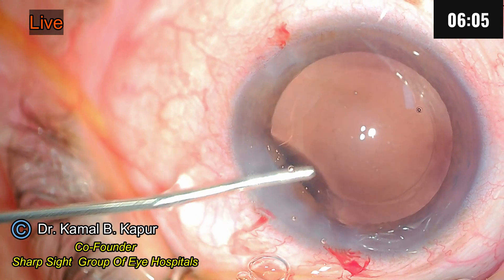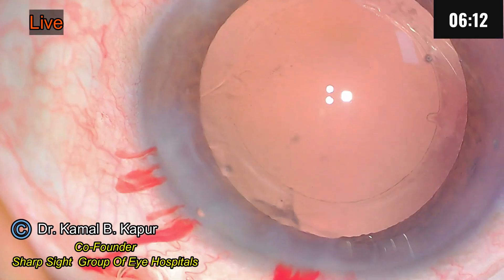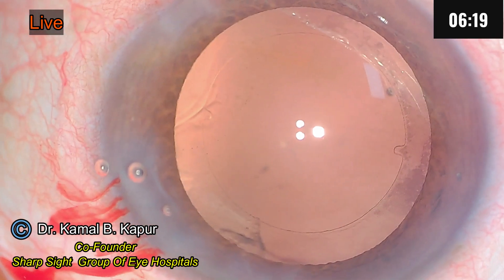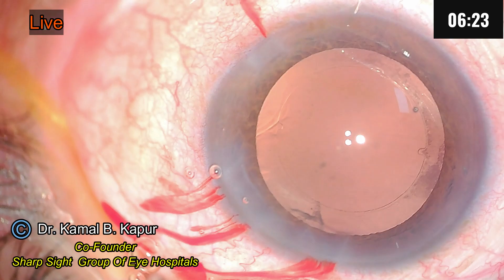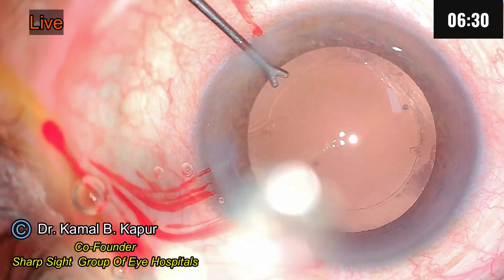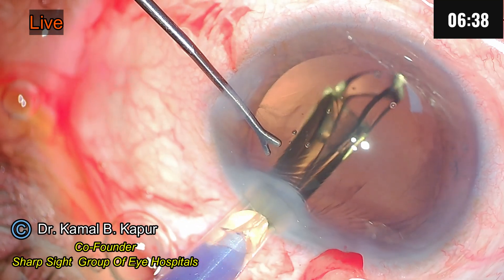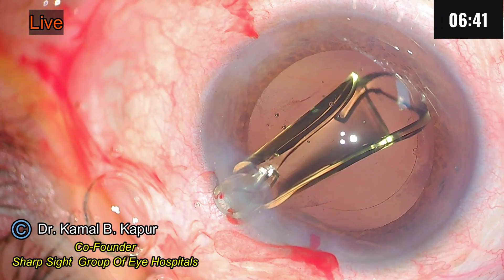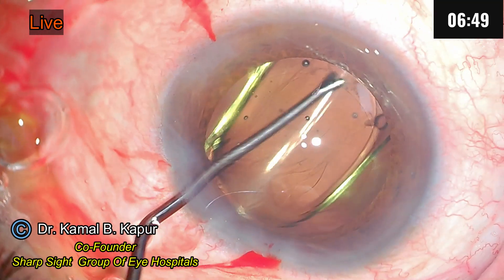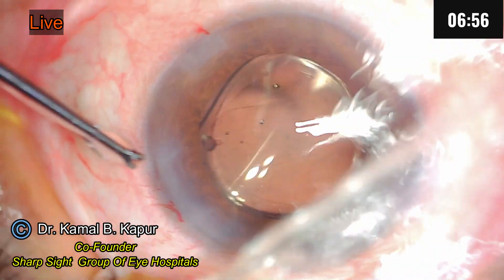Now you will be able to appreciate those two small nubs on the capsular axis — there is one here and one here. These two are visible, and this is my alignment for putting in the IOL. Now we always under-rotate the toric lens slightly — by 10 to 20 degrees — to the intended axis. I am using a magnificent EDOF toric IOL. The lens is allowed to open completely before you go in for proper alignment. So I under-rotate it slightly, 10–20 degrees, finish my irrigation aspiration, and once that is done, just align it to the intended axis.